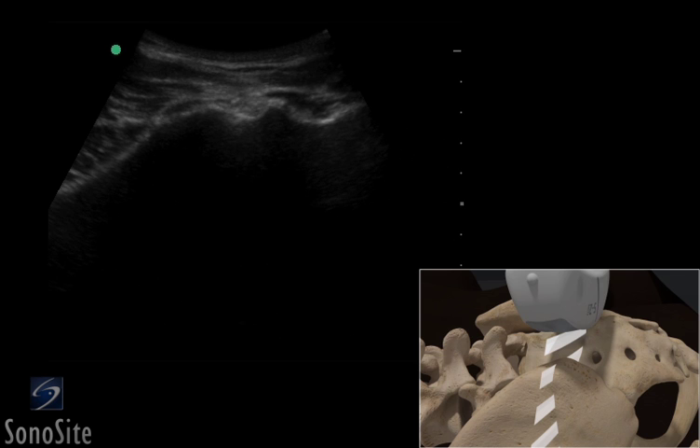The needle is inserted using an out-of-plane technique, tracking from medial to lateral toward the joint space. Hydrodissection can be used to help visualize the needle with this approach, as the sacroiliac joint space is often small.